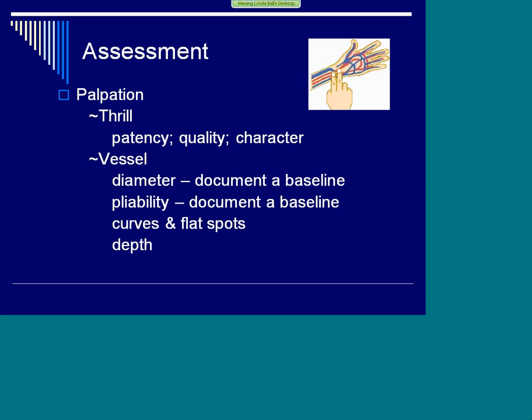And then the vessels, it's a good idea if you mark somehow the outside edges of the vessels, and we'll show you that in a few minutes, what I'm talking about, because I think it's important. I know that not everybody has the same staff taking care of that patient with the new fistula every single day for an entire month. And so the first month is critical for this. And so we need to have some objective way of looking at that access, going, this is doing really well, or this isn't doing really well.